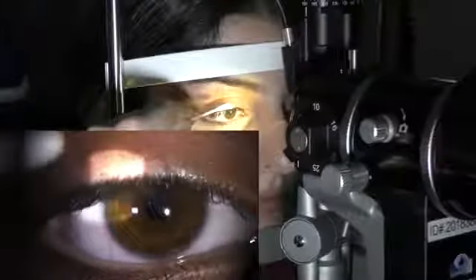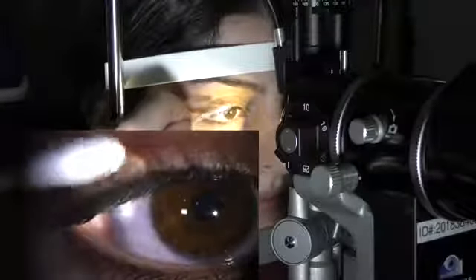Okay, now let's jump to the upper eyelid. So now we're looking at the upper eyelid. Same thing, look at the lid margins, look at the lashes and the upper eyelid, okay? Unique thing about the upper eyelid is you can look also at the lacrimal gland. So have the patient look down and just gently pull up on the eyelid here, okay? And you can see if there's any prolapse of the lacrimal gland just here in the temporal area, which there isn't, okay? Looks healthy and normal here.